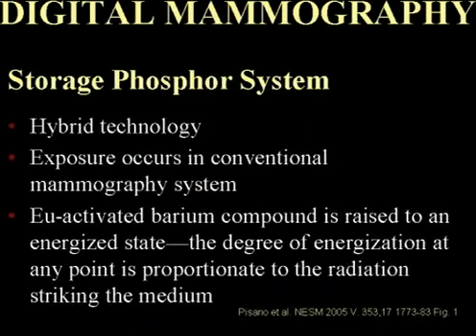Well, suppose I'm interested in digital technology, but I understand that it's going to be incredibly costly to switch over. Is there any possible intermediate solution for me which would be analogous to a CR imaging system? Well, yes, Fuji is developing that system. It is a hybrid technology that allows you to acquire the exposure in your standard analog mammographic acquisition machine. How does it do that?